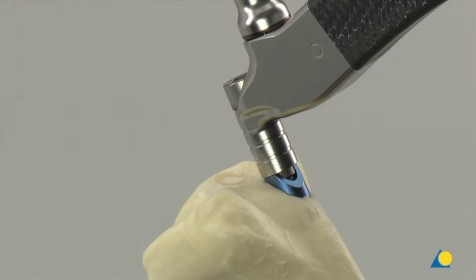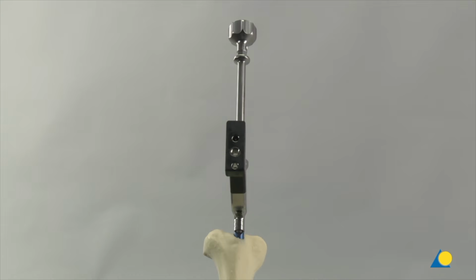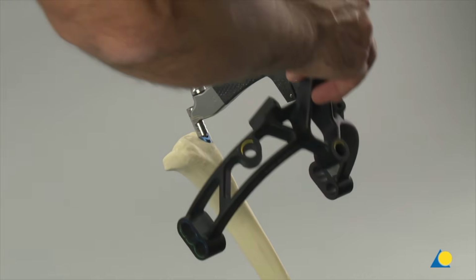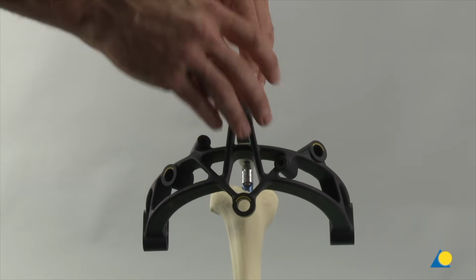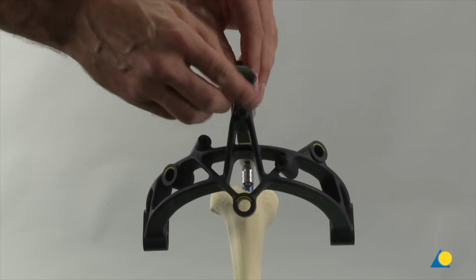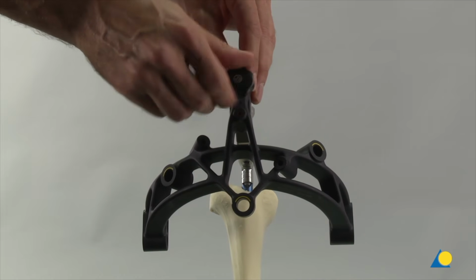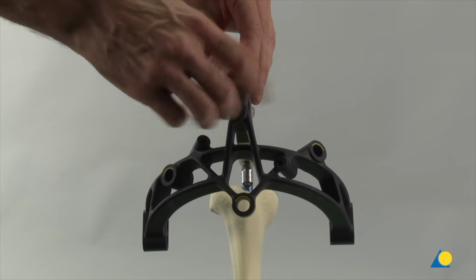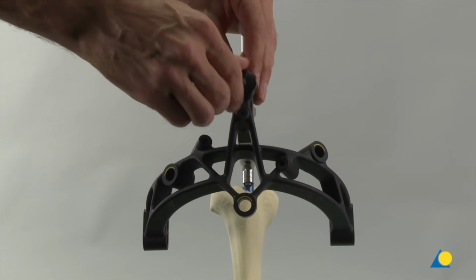The guide wire is removed. Final nail position is confirmed in the AP and lateral views. The aiming arm is attached. For proximal locking, it is important that the aiming arm is mounted only when the nail has been completely inserted. Otherwise, the aiming arm may loosen during nail insertion.